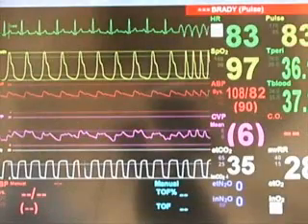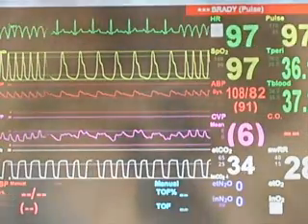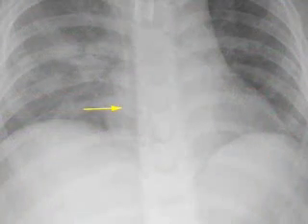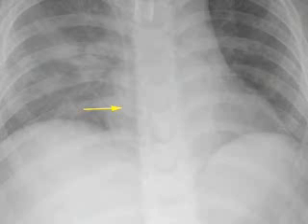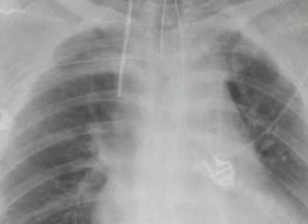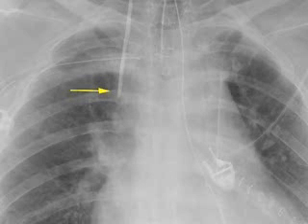If arrhythmias are seen on the monitor, the line may be in the heart, in which case the line will need to be pulled back. By approximating the necessary length of the wire before catheterization and confirming its placement with a chest x-ray, this problem can be avoided.